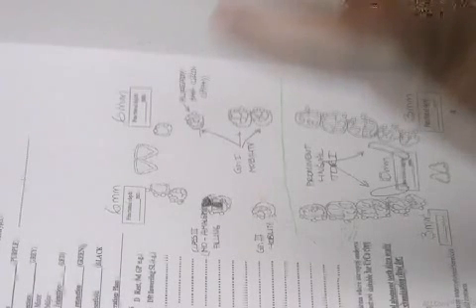No. Even if the opposite is there, even if the lower 8 is there, we usually don't extend our RPDs for biomechanical reasons too much posteriorly. There will be a lot of forces. We are satisfied with shorter arches. Even if the 7, if the opposing is not there, we don't replace the 7 as well. Okay, go back and cover the lower part. Let's cover this page.